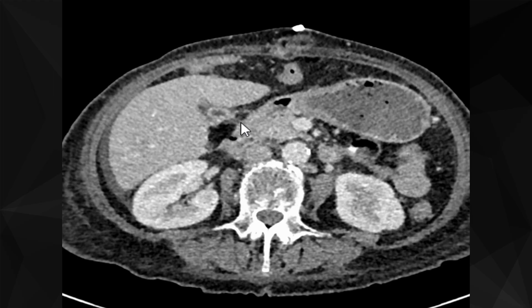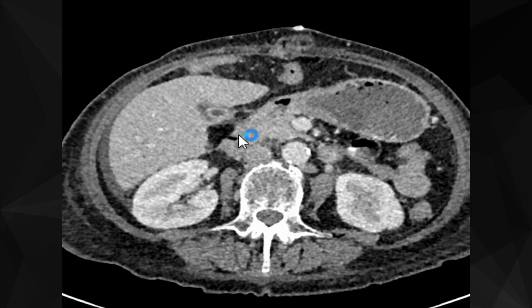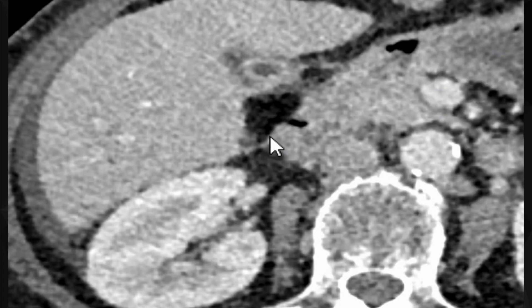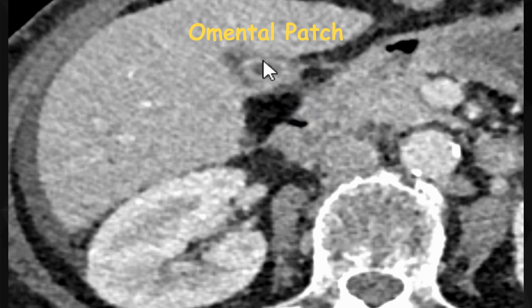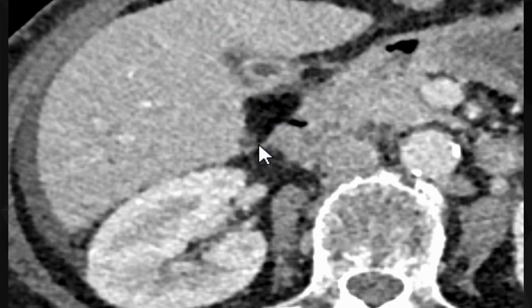At the site of perforation, you again see a bit of a defect here, but it is very neat and clean compared with the defect we saw previously — very sharply demarcated. Do you see a triangular blob of fat just overlying the site of duodenal perforation? Well, this is the omental patch. This defect no longer communicates with the peritoneal cavity because it has been sealed off by the omental patch. It is very nicely sealing the site of perforation with no further leakage.